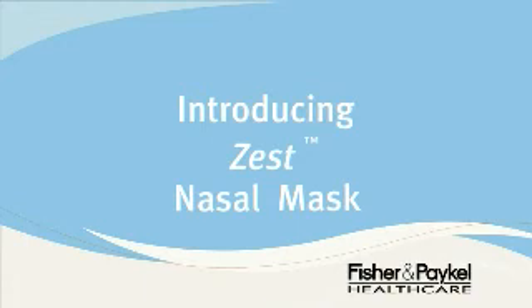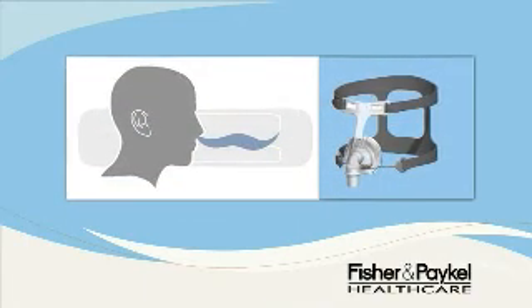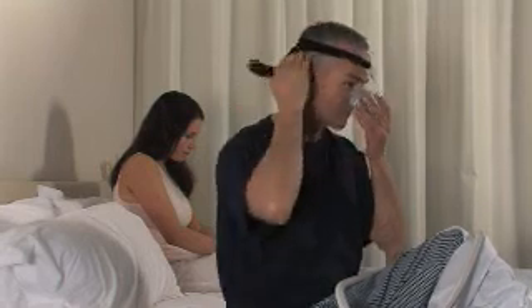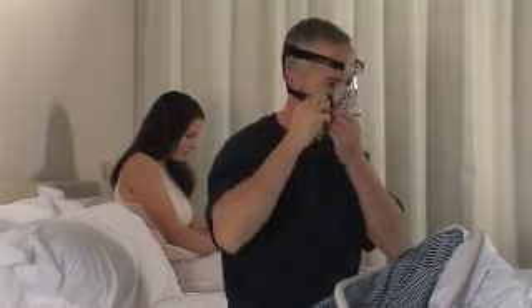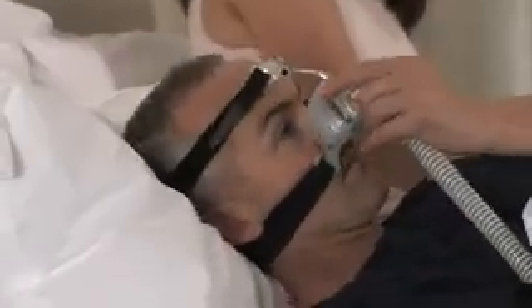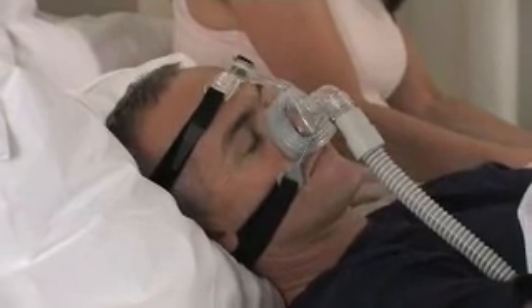You have just received a nasal mask for delivery of positive pressure therapy through the nose. Your Zest Nasal Mask incorporates FlexiFit technology with auto-contouring properties. This means it automatically adjusts to a wide range of nasal contours with simple, one-step, easy fitting and no complicated adjustments.